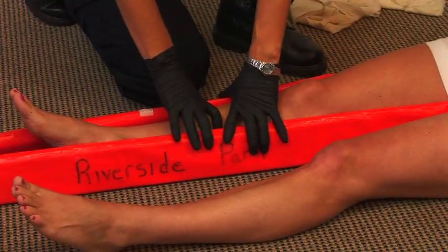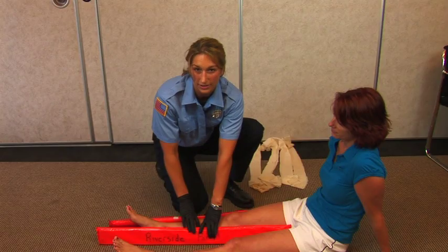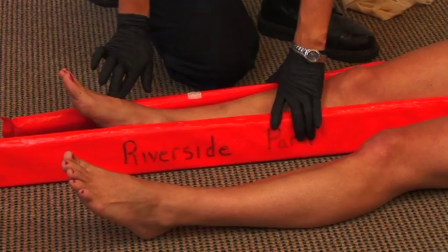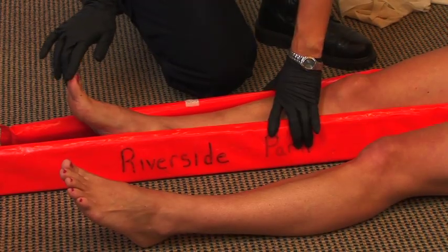Before applying the splint, you want to make sure that the person has pulse, motor, and sensory to their feet. So check for a pulse. Can you feel me touching you? And can you move your toes?